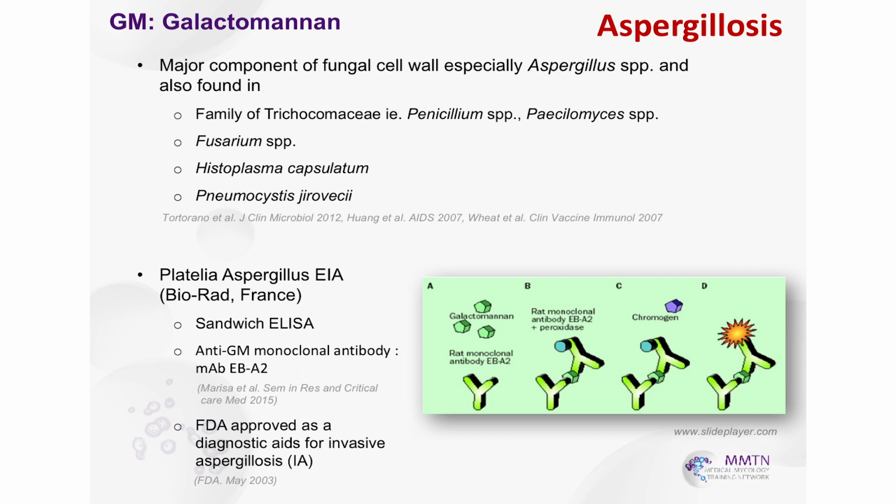So how can we identify that? You can see from now on, everything comes from the cell wall of the yeast or the mold. Everything from the gate. Now the scientists are very clever. We have to observe what this gate, this door, is composed of before we open the door. So now we come to Aspergillus. The outside door of Aspergillus is galactomannan, GM.